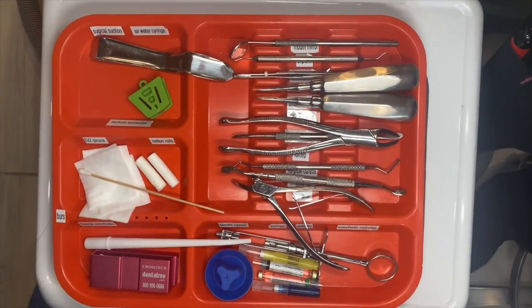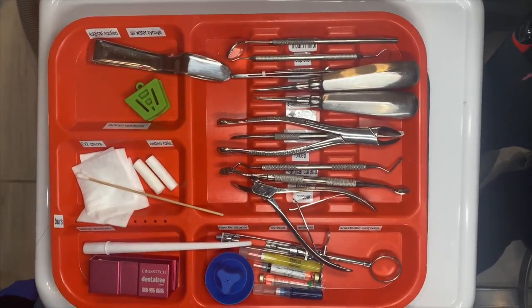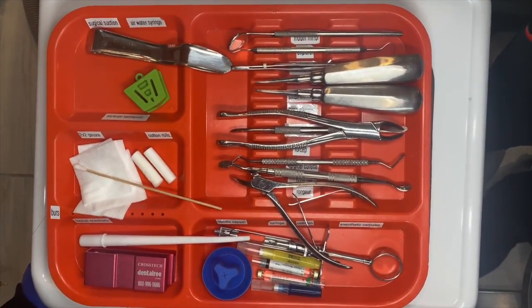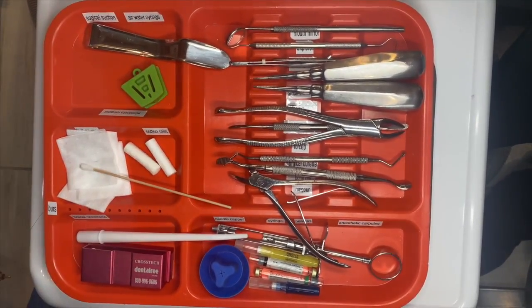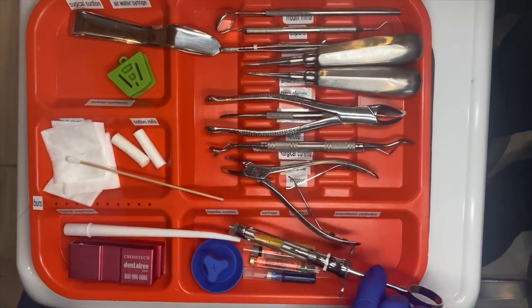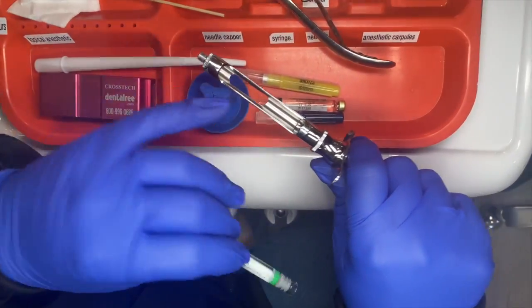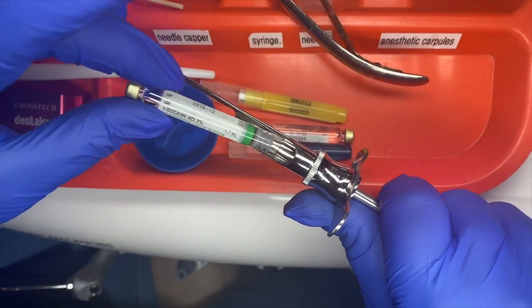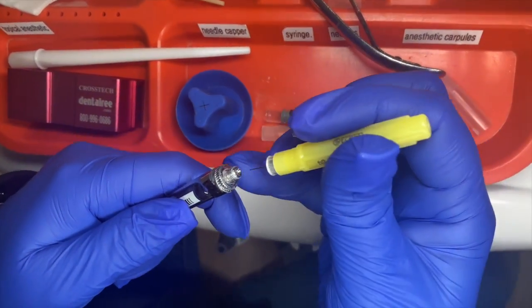This is our extraction setup. There are different instruments for extractions, but this is a start. We have our cotton tip to place our topical, we have our anesthetic syringe. Depending on the tooth number — let's say we're going to extract number 30 — we would place our anesthetic into our anesthetic syringe, open it rubber tip down, and we would use our yellow needle, our long needle, for a block.